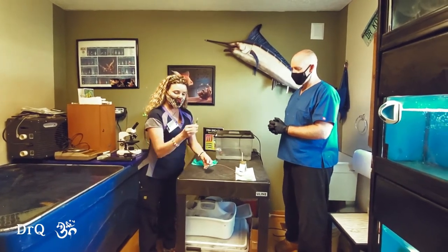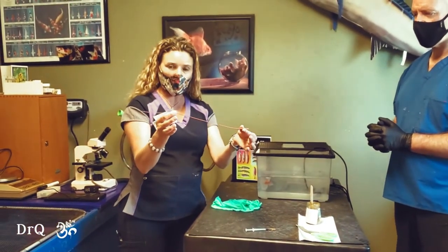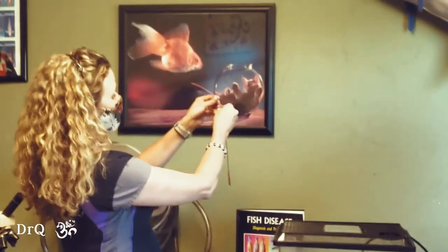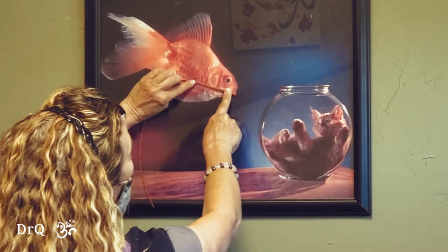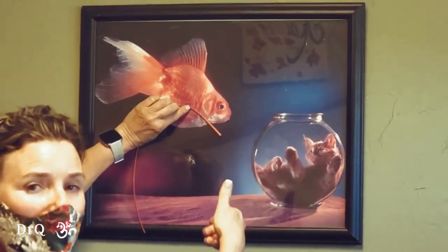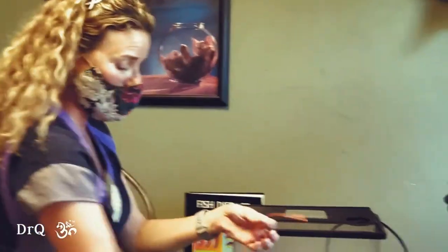You're going to take a syringe like this, which we've already pulled up some baby food, and a typical red rubber catheter that any veterinarian would have. What I want to show you is that on this picture here, you want to measure from where the syringe is going to be, past the gill cover, to make sure that your red rubber catheter is going to pass the gills and get into the GI tract. So I put a little mark here already because I already measured, so I'm going to cut it there.